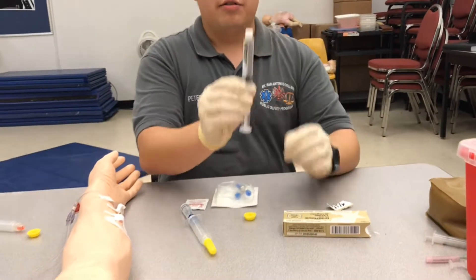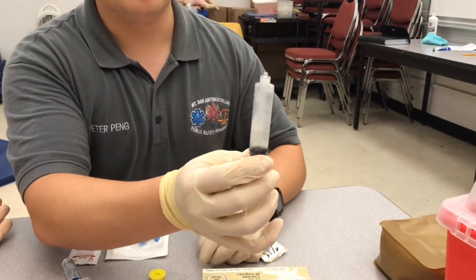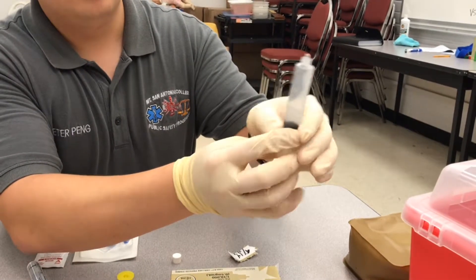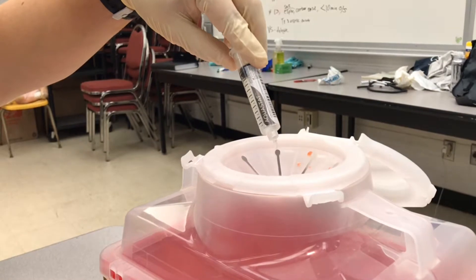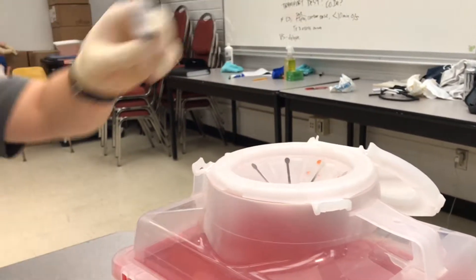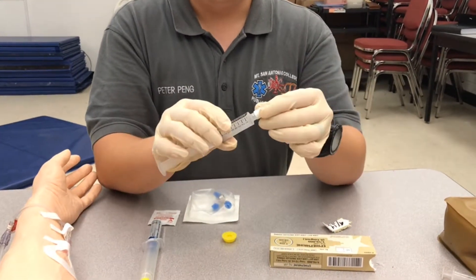With our flush, we're going to expel 1 mL so we want to have 9 mL. Get down to the zero line. Make sure you keep your caps sterile so you can reuse them.